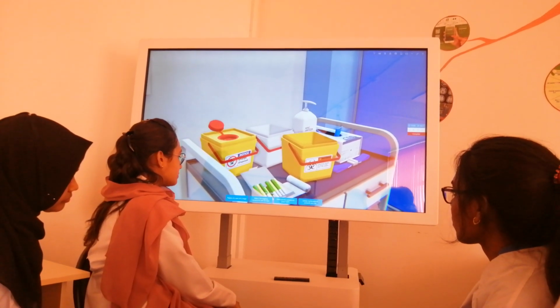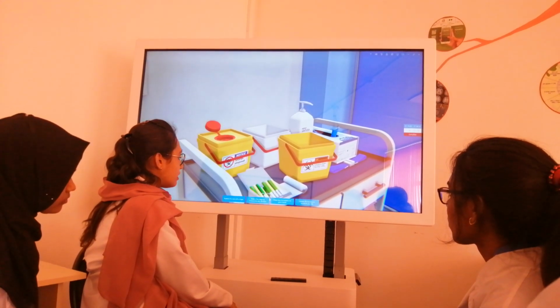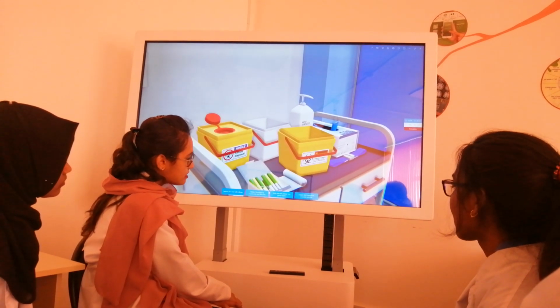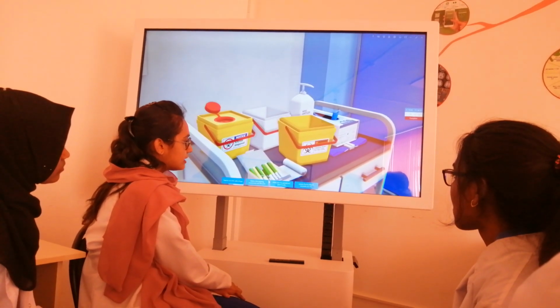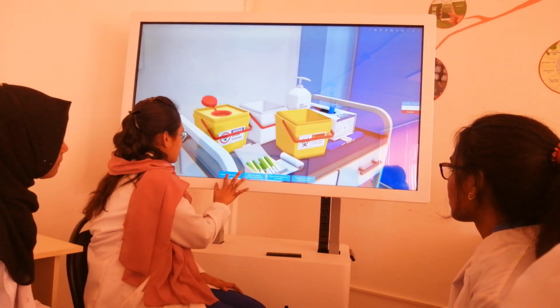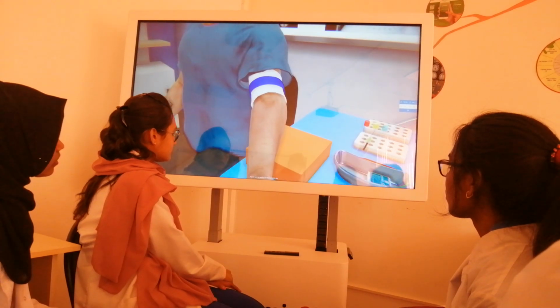What process should be the following? Fixation of vein with a finger. Make a few wiggling movements with the tube. Make sure the patient is in good health. Loosen the tourniquet. Unclench your fist. Fixation of a vein with a finger. Fix the vein by pulling on the patient's skin.